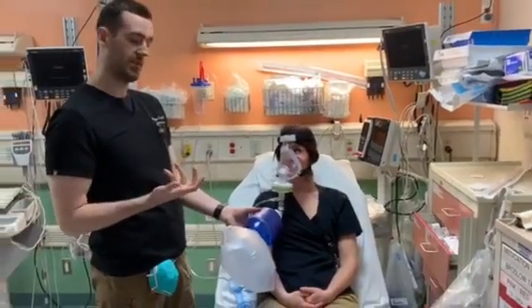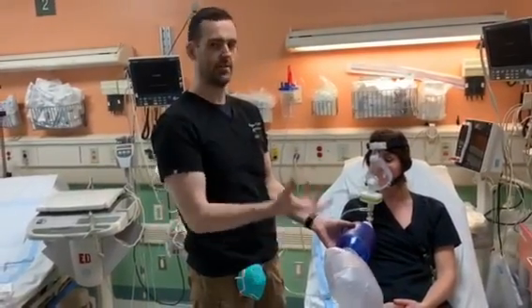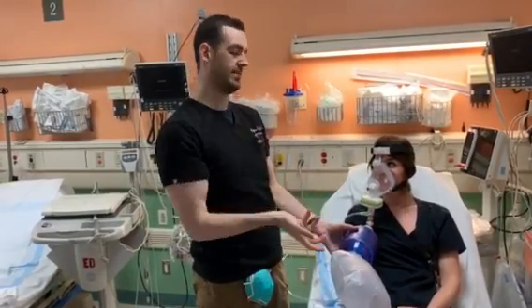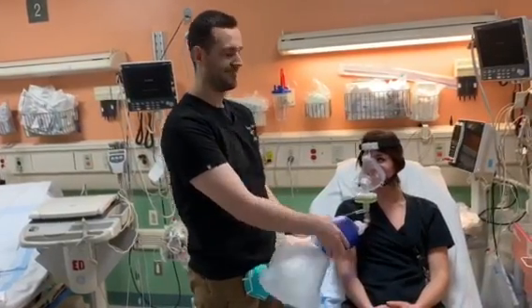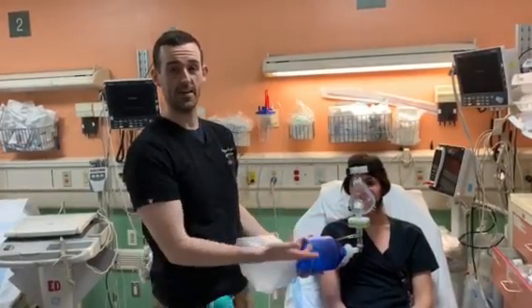If the patient is already breathing, they'll be able to breathe in and out normally. They'll feel the PEEP — they have to breathe out against resistance. So you'll pre-oxygenate them even if they're still breathing. And if they get sedated or go apneic, you can still bag them. It's a closed circuit — everything is closed. So that's how you set it up.